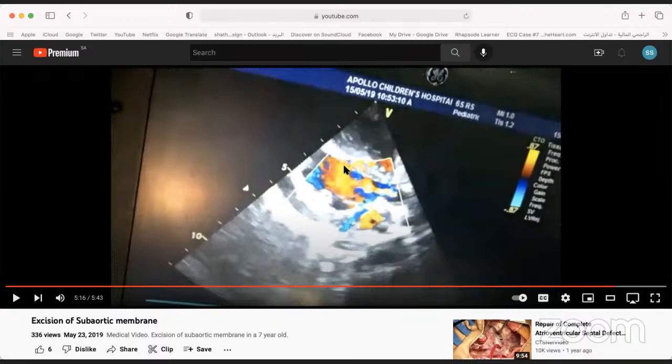The blood now is filling the heart, and you communicate well with the perfusionist that you are clamping, so they make sure they don't lose too much volume and do not reach air embolism levels, right? So now the right atrium is full of blood, and then? The blood will go to the right ventricle and we'll see if there is blood going from RV to LV. Okay, that's very good understanding of the hemodynamics and pathology. And you're right. If you do that, then you don't have to wait until you come off bypass and do the echo and repair it. How would you repair that VSD?